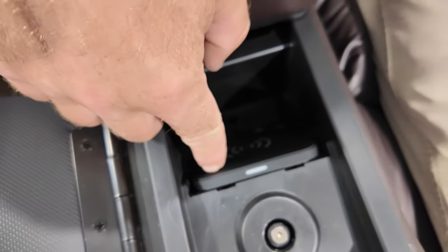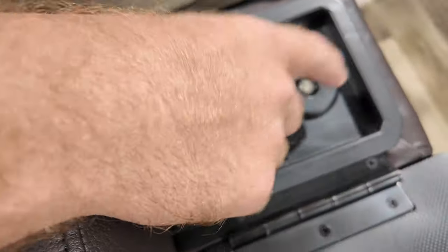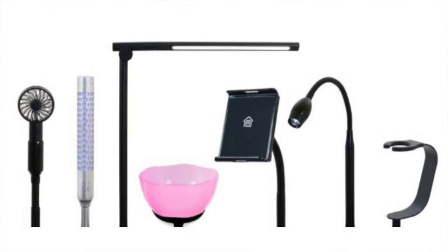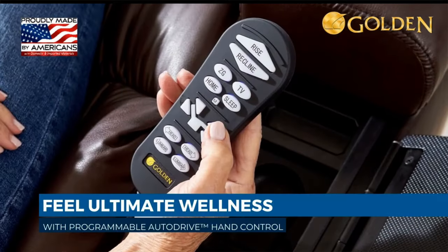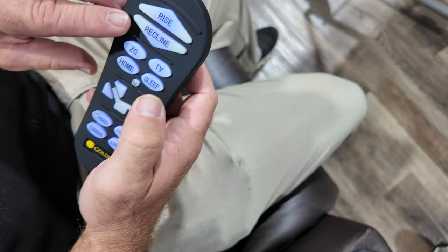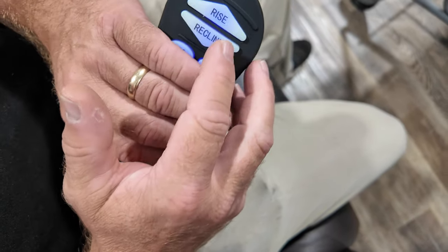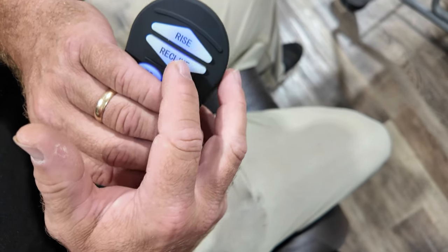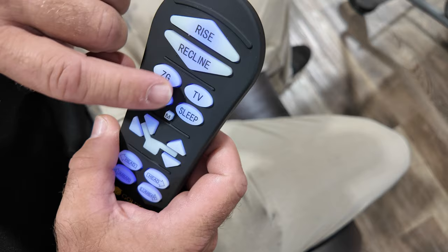This is a wireless charging port for your phone — this is the power dock station, which holds multiple accessories. Right here is where you keep your hand control, which can be easily pulled out. This hand control has a bunch of buttons, but don't let it confuse you — you can completely control this chair with just these two buttons.